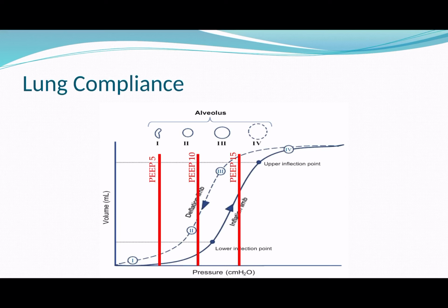Now you see this in APRV. You can see patients, they look like they're hyper expanded, their lungs are expanded up and they're breathing away on top, and it can look like they're being quite uncomfortable. But actually, these patients find this a lot more comfortable than PEEPs of 10 or 5, where they're having to generate bigger changes in pressure to get a breath in.